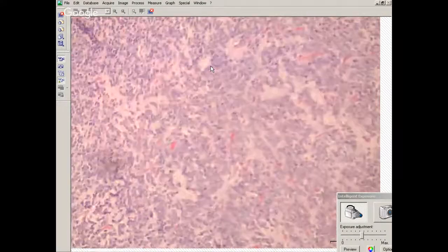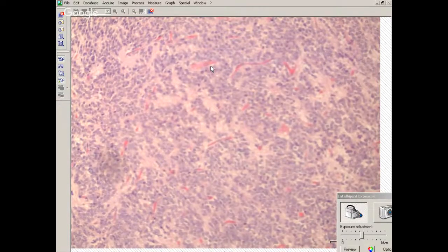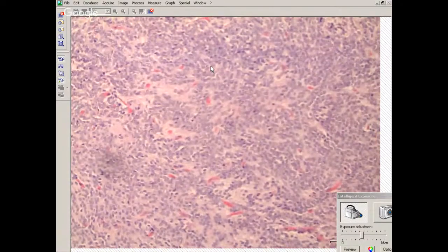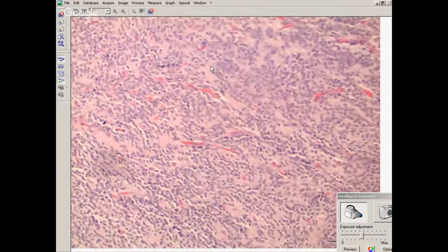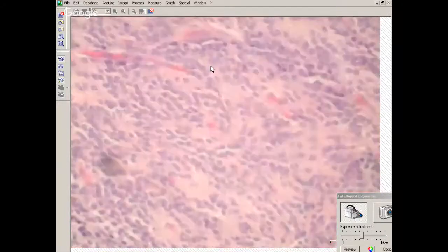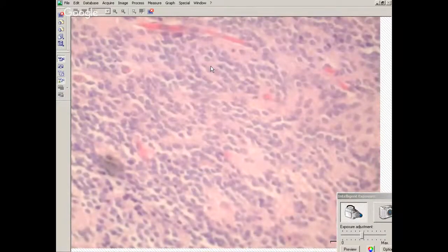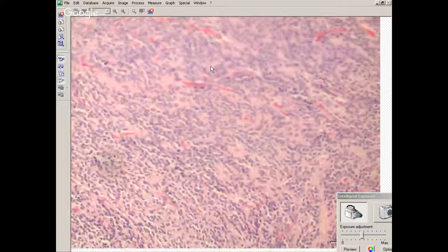And it kind of looks like, if it were in the brain at the periphery, it might look like an oligodendroglioma. You could certainly confuse it, it kind of has maybe some blood vessels with some fibrillary processes around them. That might be a blood vessel. So ependymoma, the scope on this power is not so great. It's probably somebody got oil on it. So this is a neurocytoma.